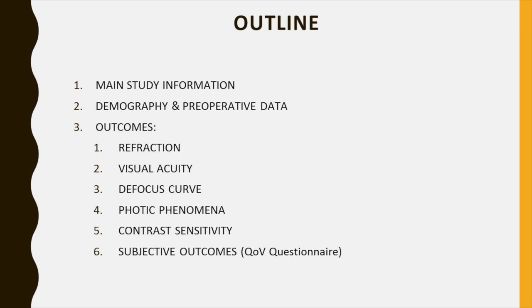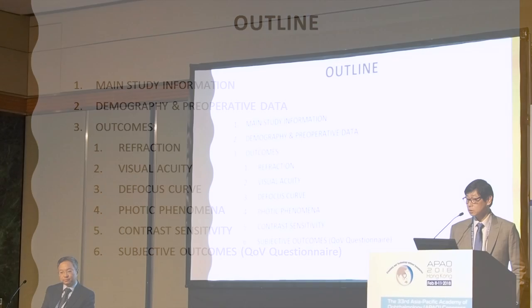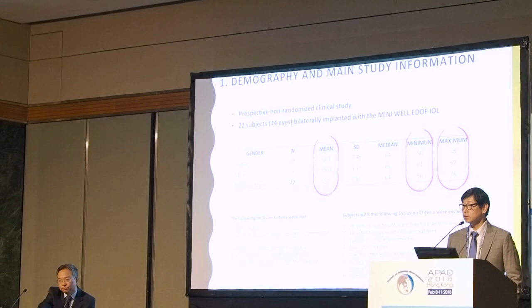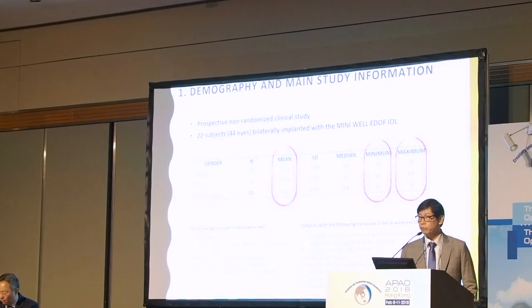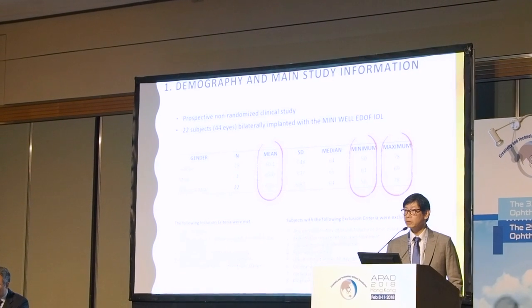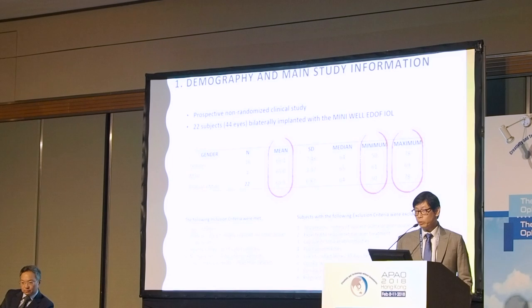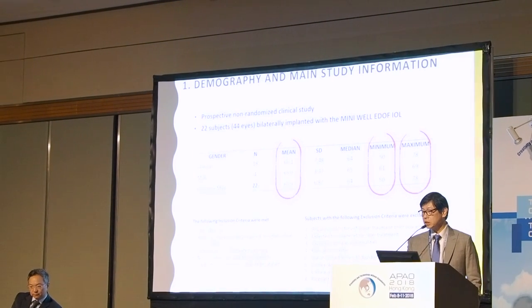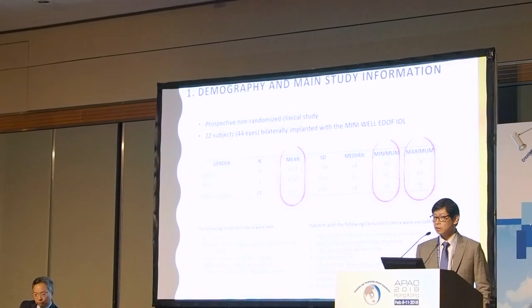But long story short, I accepted, and I'm going to report to you now the results. We did a prospective, non-randomized clinical study last year. We did 22 subjects, 44 eyes bilaterally implanted with the Mini Well EDOF lens. We did more females than males. The mean age is about 66. The youngest was 50, and the oldest was 78.